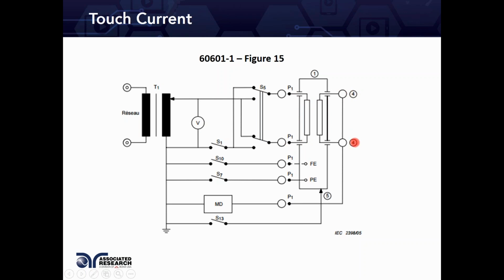These, mentioned in section 4, are any applied part that is functioning as an applied part. Is there any resulting leakage current due to this application of voltage that's powering up your device? Is there any leakage current that's being felt by the applied part? Again, this is one of the scenarios where having open ground or closed ground doesn't really affect the leakage current that's being seen by the applied part.